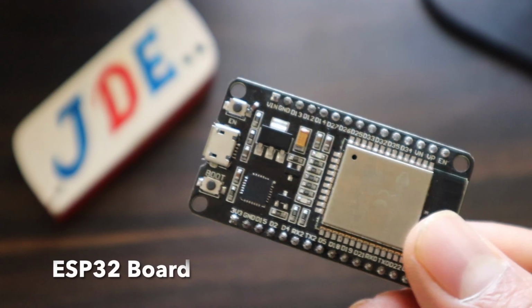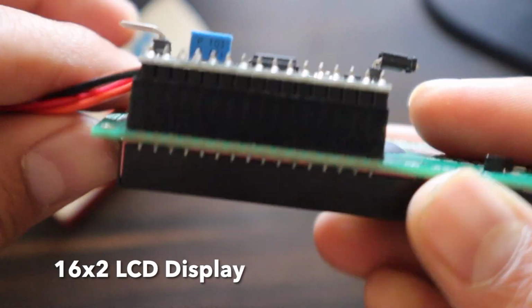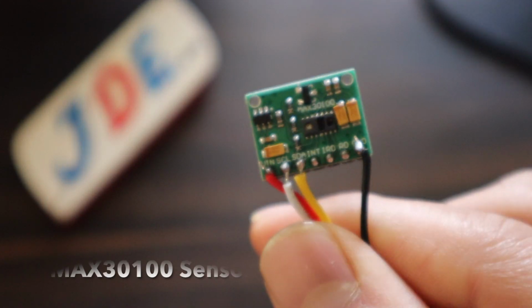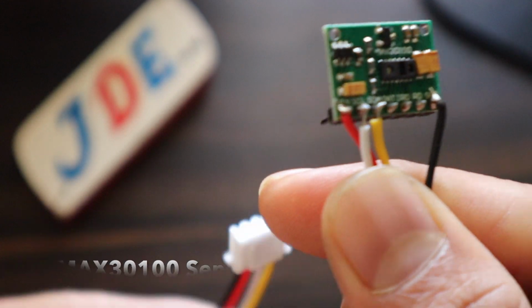We require a few components like the ESP32 microcontroller board, a 16 by 2 LCD display with I2C module, the MAX30100 sensor, and a zero PCB.